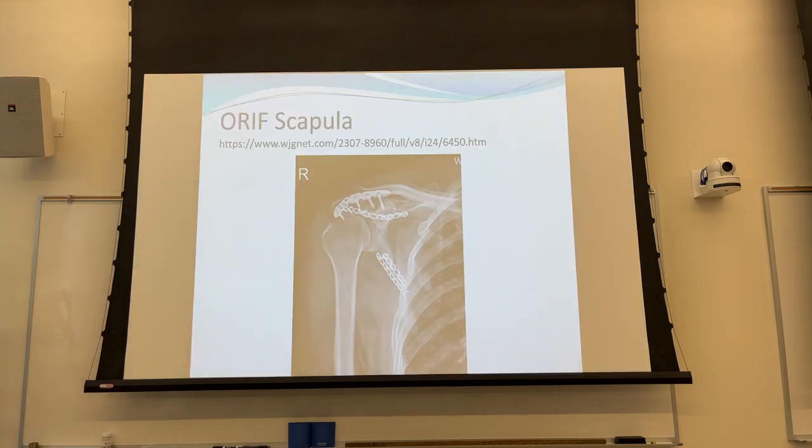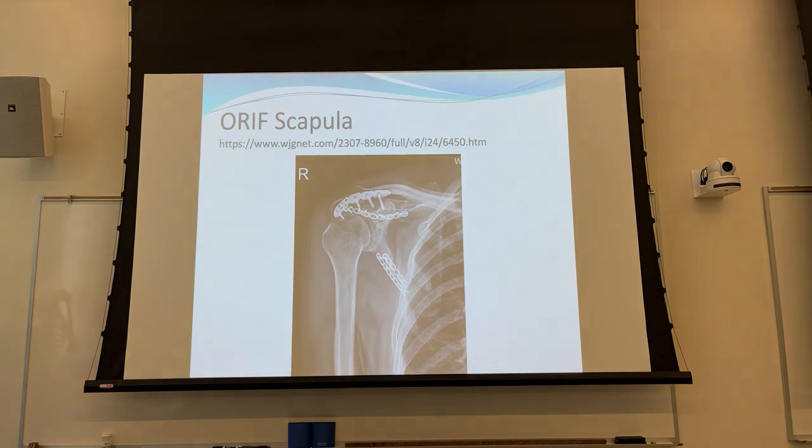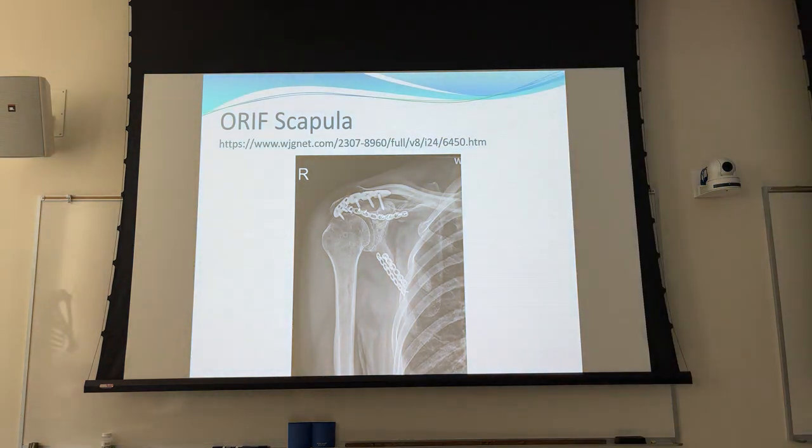So we don't have, again, just a whole lot to do today, so we shouldn't be here all that long. Just a few projections, and we could spend 2 semesters dissecting this book. It's got a lot of specialty views in it that we could talk about, but the views that you're going to learn are for if you go to work in an orthopedist's office or something like that. So just for general hospital work and normal clinic work, you're just not going to see those views, so we're not going to cover them. So there are a few things we need to talk about. So we looked at that one.